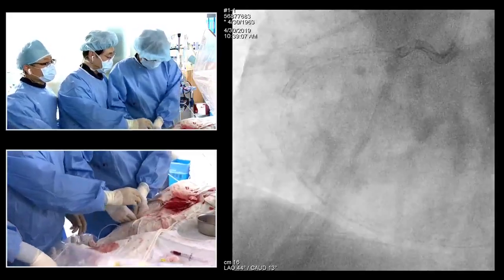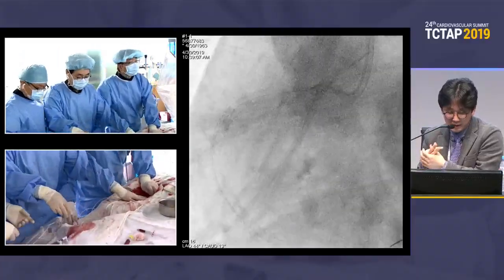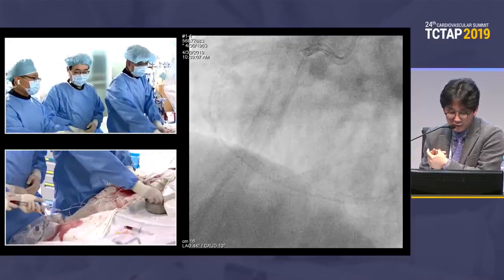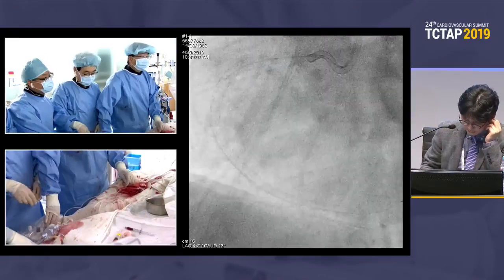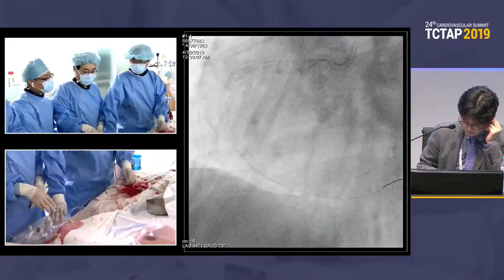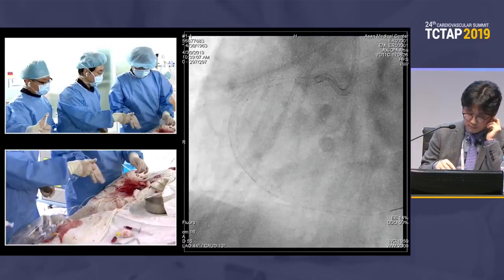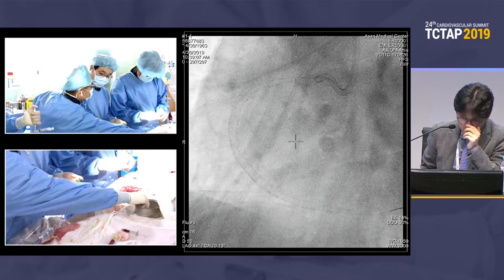So, could you tell me, I heard that you recently analyzed the IVUS data of Asan Medical Center, and there you made a cutoff for future events in terms of the MSA. What is it? Our team also analyzed our IVUS findings in around 1,000 cases. Among them, more than 700 cases had analyzable post-stenting IVUS findings.